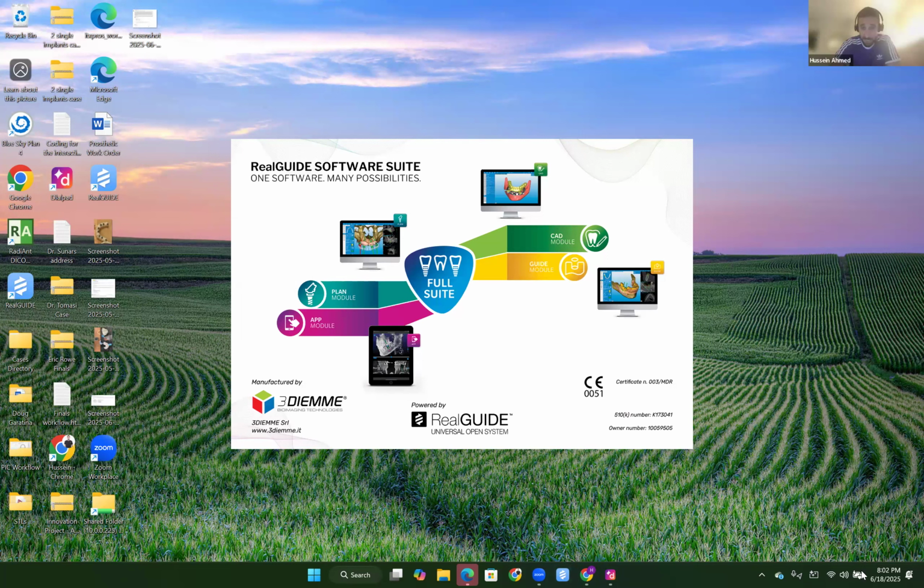So first case for yours, Dr. Gupta, it's Mike, and you've left a note that you're planning on doing implants at 19, 21, 22, 25. Is it a full arch case, Dr. Gupta? Yes, it's a full arch All-on-X case.